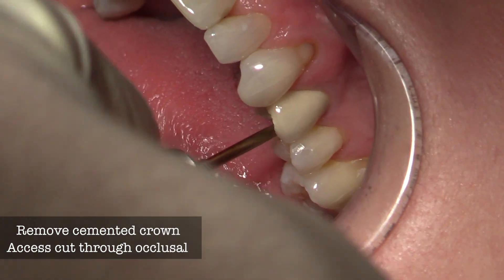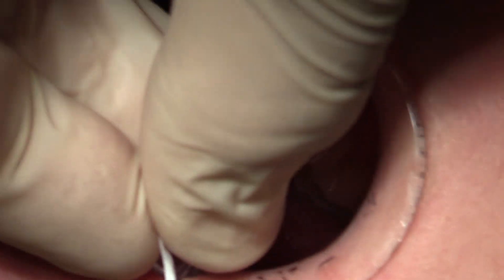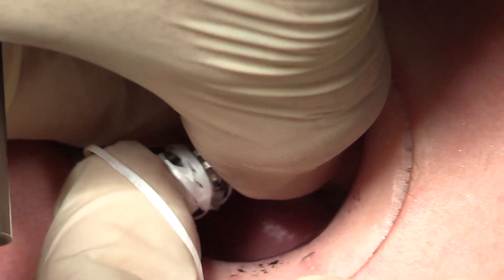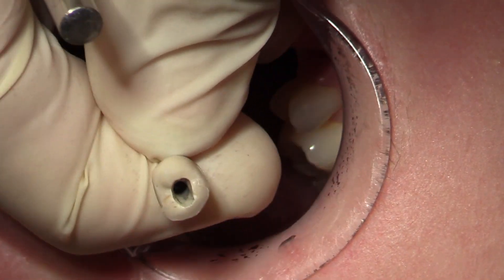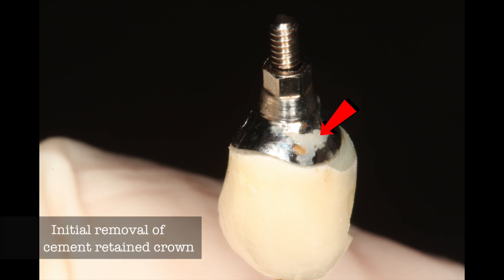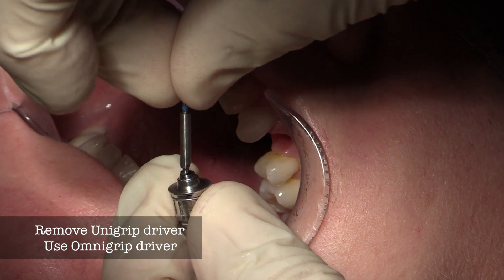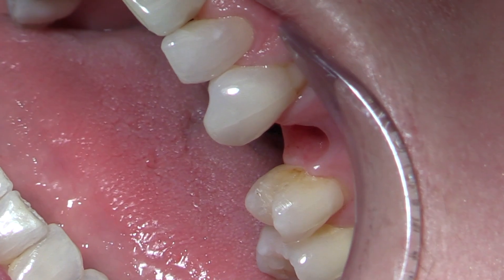Now that we have everything checked on the model, we're going to take the unigrip driver and remove that fractured crown so we can place the new ASC abutment. We'll back it out — it's been used as a temporary in the meantime — and once we back it out, we'll be ready to place the new abutment fabricated for this situation. The cement we found underneath the abutment was caused by this particular undercut, so by using a screw-retained option, we don't have this problem whatsoever. Using the unigrip driver, we bring out the latch-type driver and place the OmniGrip driver — the only tool you need to purchase for this procedure.